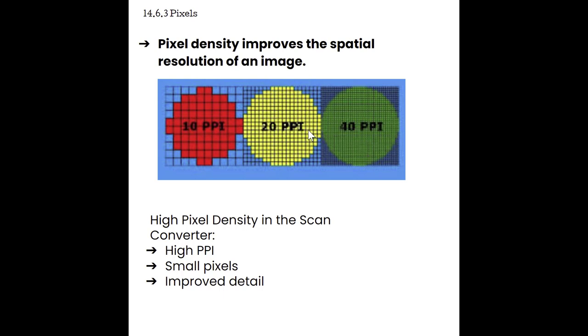And this really highlights, again, we can't add more than one gray. We could make this circle very nice if we could split these pixels in half, make half red, half blue, but we can't do that. It's all or nothing. It's red or blue. It can't be both. And that is why with our 40 ppi, we really get a smoother appearing edge because we have much more detail with those extra pixels in there.